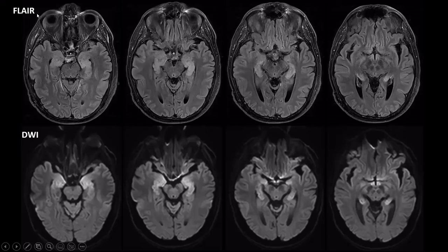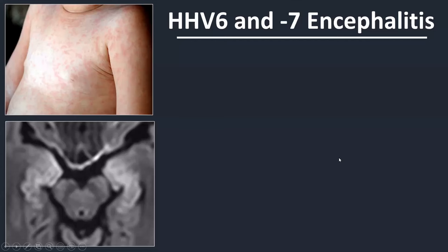These images provide an overview. On top we have the FLAIR images and diffusion-weighted images from the second MRI. We see that the structures involved are the hippocampus on both sides and also the uncus on both sides — the mesiotemporal structures. The hippocampus is entirely involved, both head, body, and tail, associated with diffusion restriction. The abnormalities are completely limited to the hippocampus and mesiotemporal structures on both sides, with no involvement whatsoever of extra-limbic cortex.